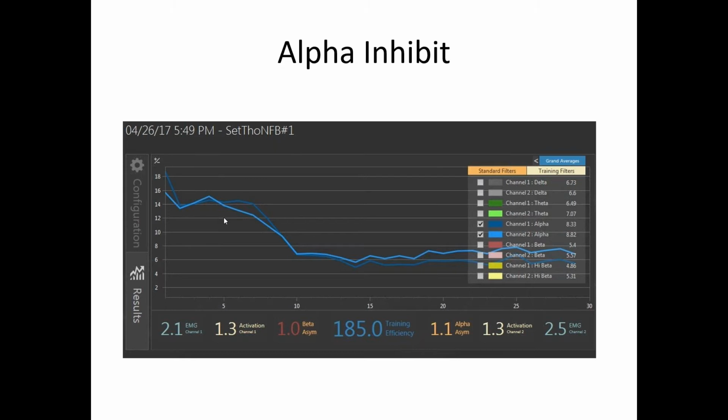And everything in nature goes through phase transitions, particularly if it's biological. So that's Martin's favorite playground. So we're looking for these phase transitions. And so when you see somebody producing artifact, they're going through a phase transition, both mental, probably psychological, and physical, and they're moving in consequence.